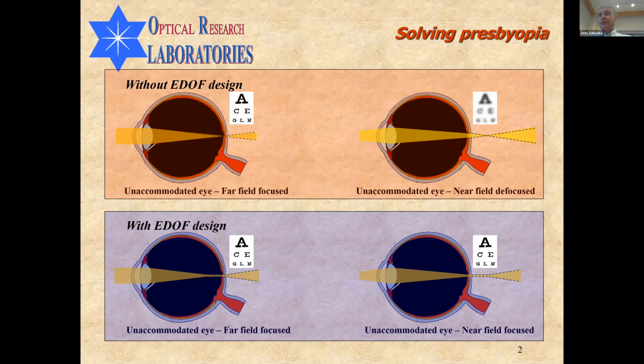And what we wanted to develop in the last 10, 15 years is a certain optical device that can be a contact lens, intraocular lens, or even spectacles that are monofocals. They have a single focal length. And by adding special scratches, special patterns which are embedded on the surface of those lenses, we perform a significant extension of the depth of focus which is obtained for that given lens. And if we have an extension of the depth of focus, you can look at the second row of my slide. Instead of having a single focal spot, we now have a channel of focus.